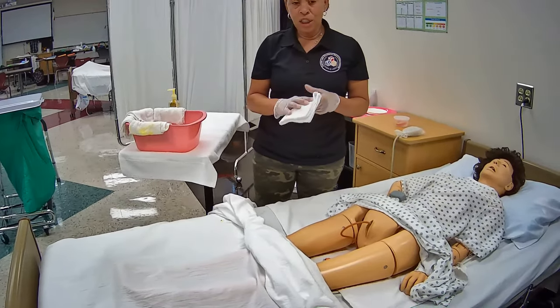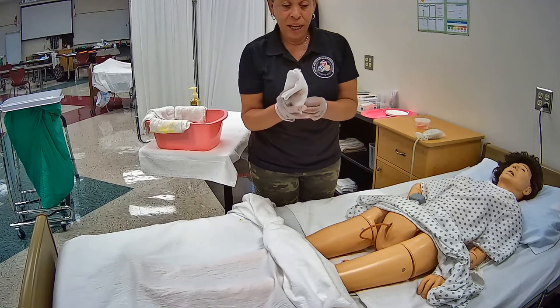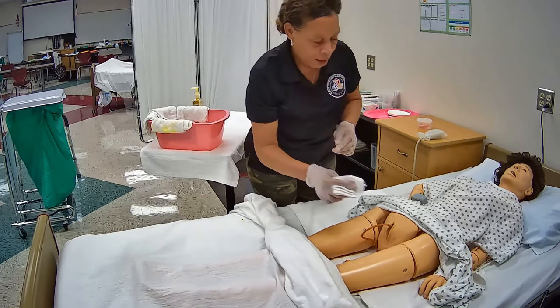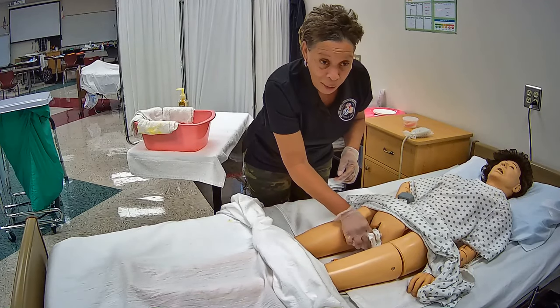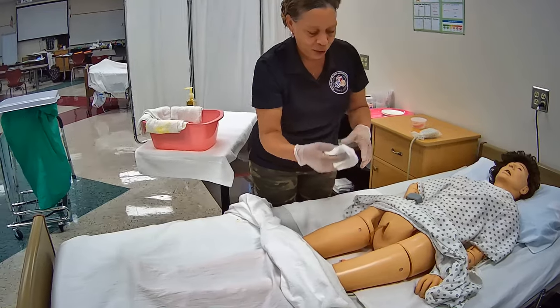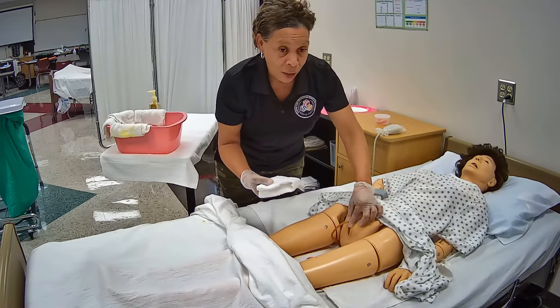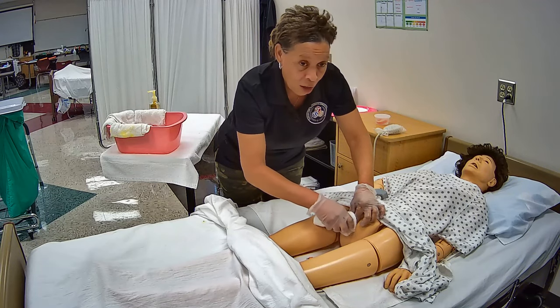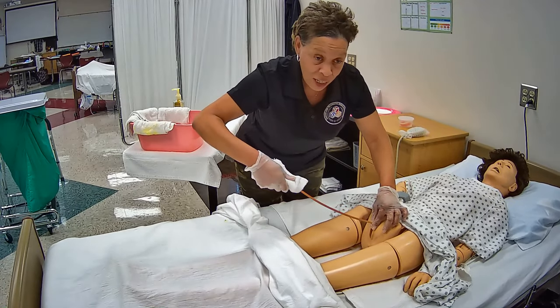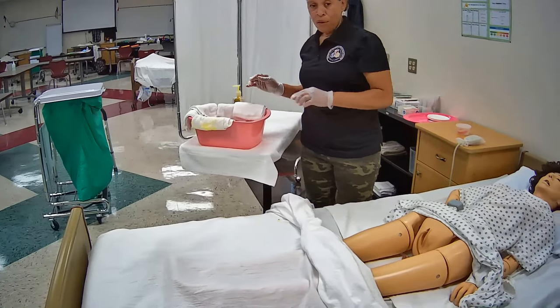The fifth washcloth I'm going to use to dry the labia, the front perineal area, and the catheter. I'm going to fold the washcloth in my hand so it won't be dangling. I'm going to dry inside the labia furthest from me, flip the washcloth, then dry inside the labia closest to me. Then I'm going to flip the washcloth over, hold the catheter as close to the meatus as I can, wrap the washcloth around the entire diameter of the catheter, and gently dry the entire length. Then place it back down and place this washcloth over my basin.